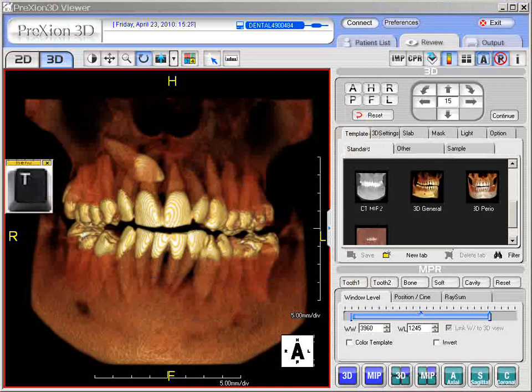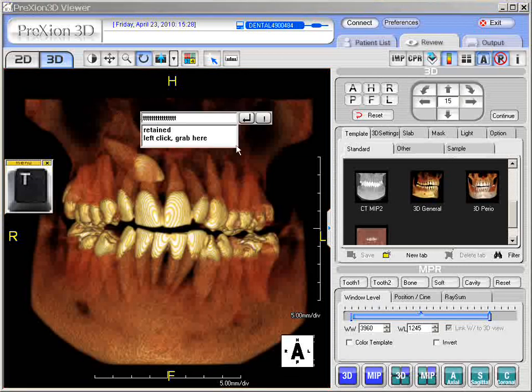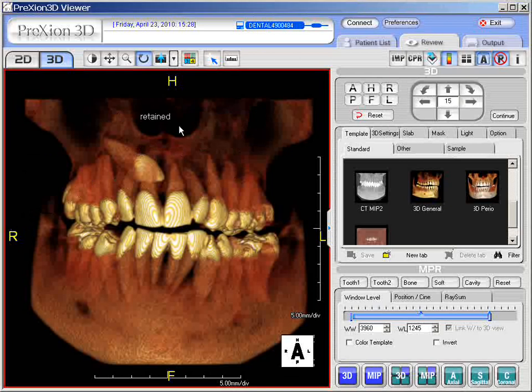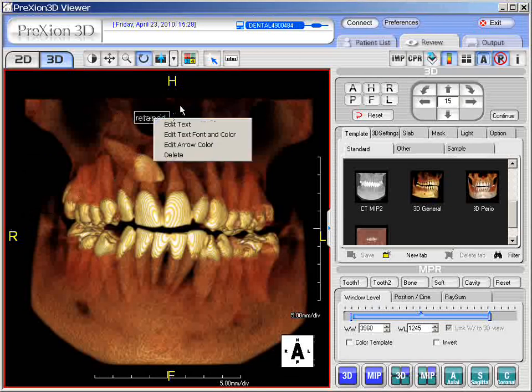Another way to add annotation or just text is to simply press the letter T on the keyboard. Once you do that, you can click in the field and write in whatever you wish. You can simply type it in the field, or if you just want to say 'retained,' you can click it in. You can move this if you wish or edit it as previously shown.